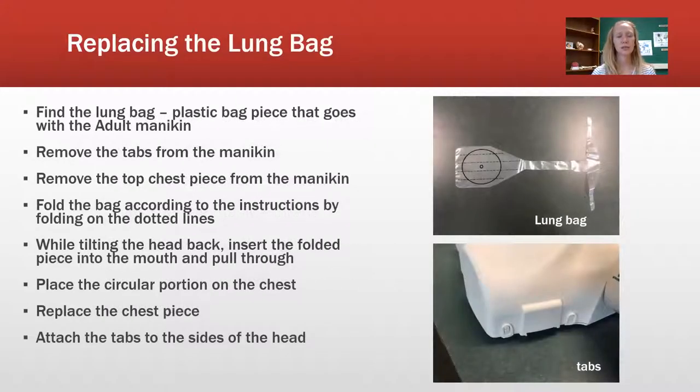So replacing the lung bag — I have it listed out here step by step, but I'm going to show you in the video. First, you want to locate the lung bags; they're usually in the bag that comes with the mannequin. There are 10 tabs all along the mannequin. You're going to fold the bag down the dotted lines, put that piece into the mouth, line it up where it goes, replace the chest piece, and attach the tabs on the side of the head.